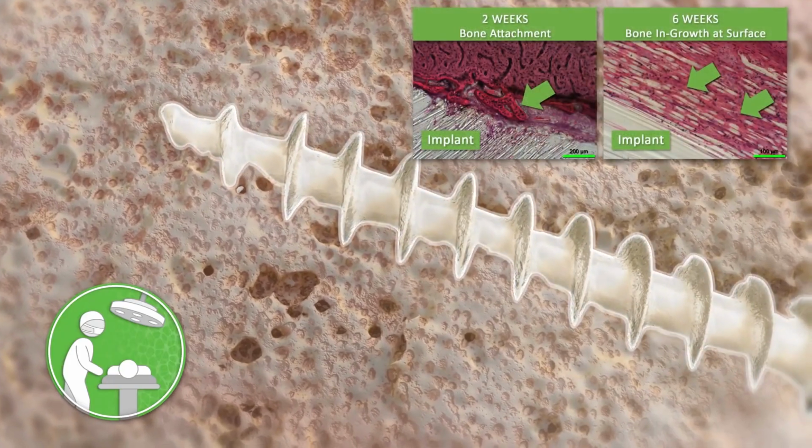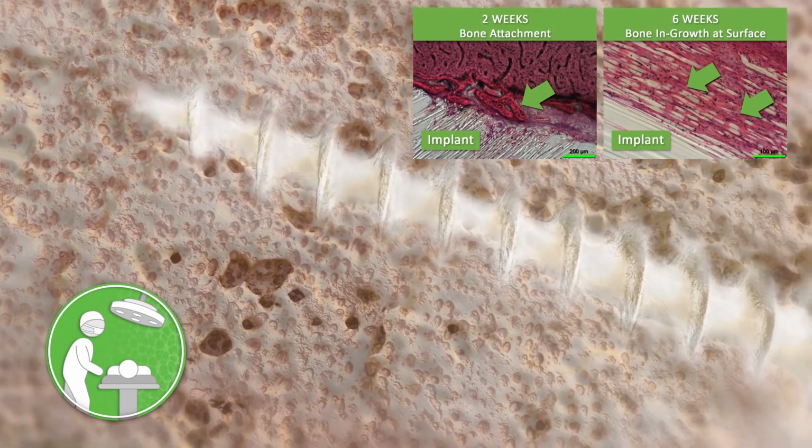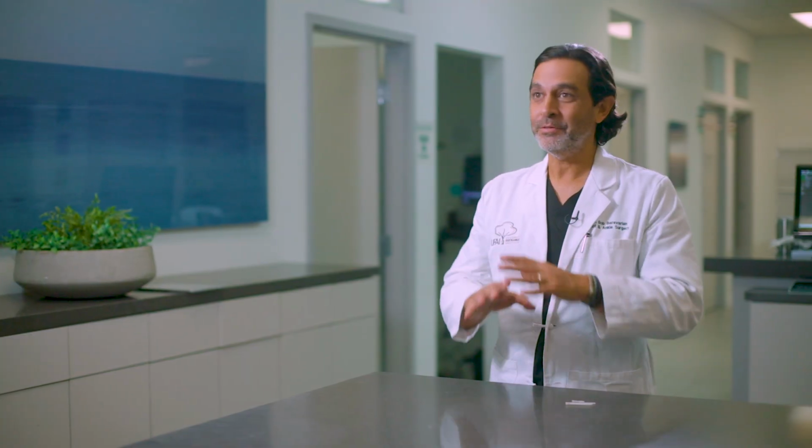So you do a surgery on someone in their foot and you put in this screw to keep things together, and eventually it becomes melded with bone. And becomes bone. It becomes bone. So all of that metal that used to be in the body, no more. The nice thing about the Ossio is that I seem to have fewer patients that have to take a big break from their rehab. This Ossio material doesn't just come in a screw.